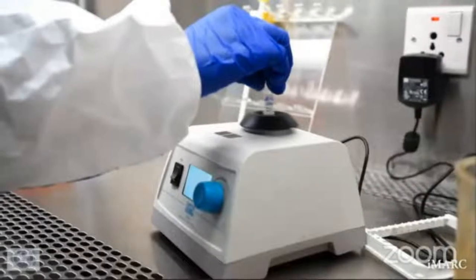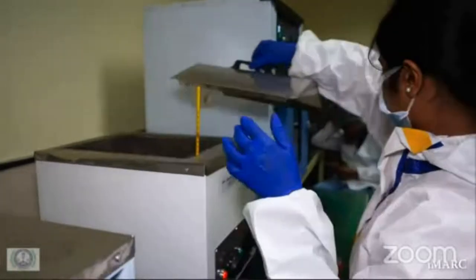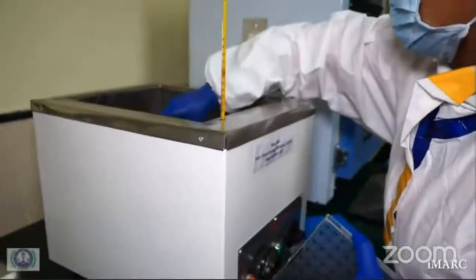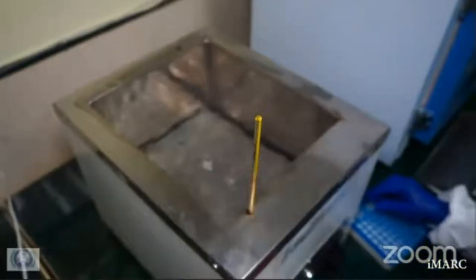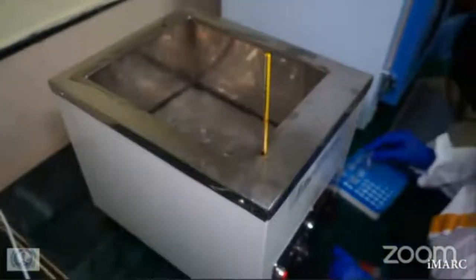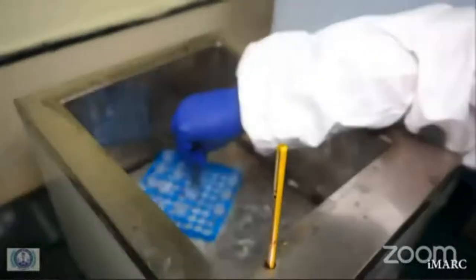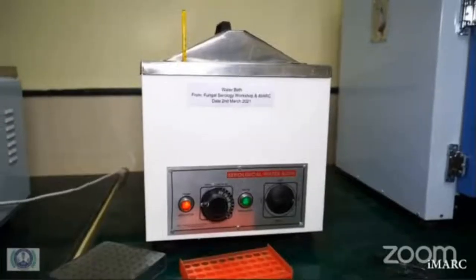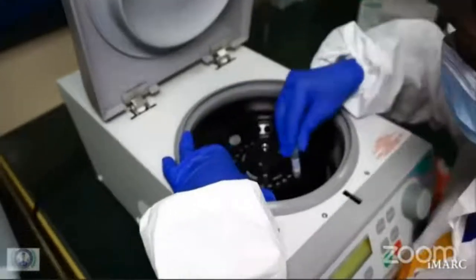After vortexing, heat the tubes for 3 minutes at 100 degrees centigrade in the water bath. Always remember, tubes must be placed in the water bath only when the prescribed temperature is reached. After the heating step, carefully remove all the tubes from the boiling water bath and place them in a centrifuge. Centrifuge the tubes at 10,000 RPM for 10 minutes.